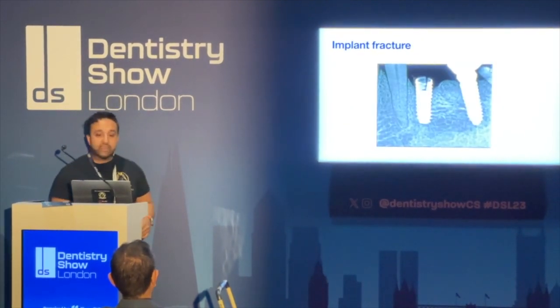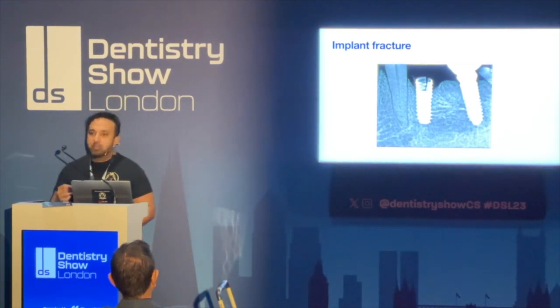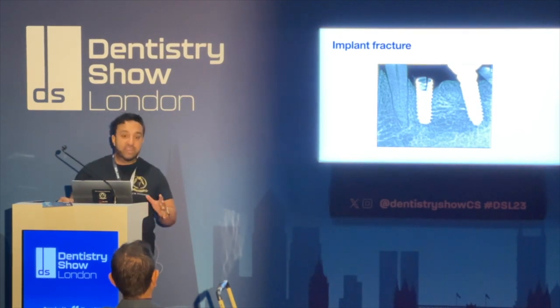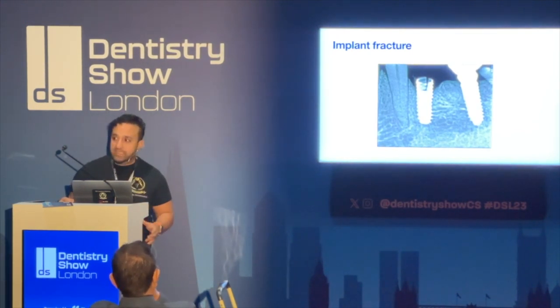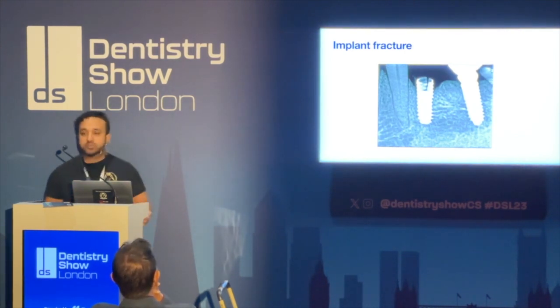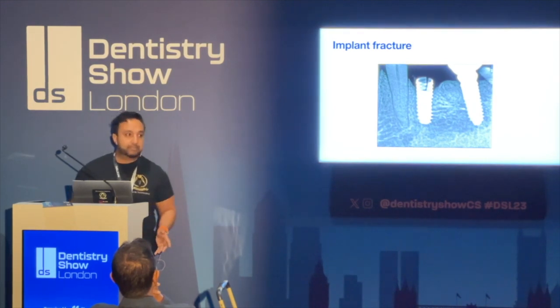Implants do break. They fracture, okay? And we're seeing it more and more nowadays. So your patients do get disappointed, and rightly so. They've paid a considerable sum. Implants are between £2,500 to £5,000 a fixture, and they've broken it.